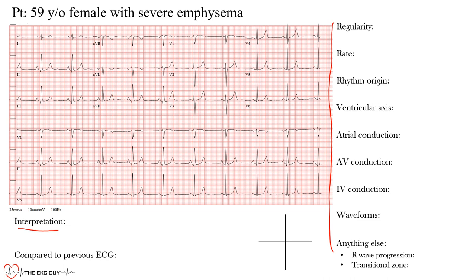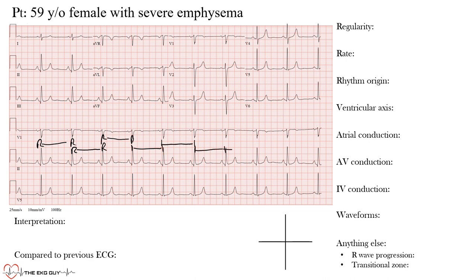When you're ready, start the video and we'll go through this together. So here we have a 59-year-old female with severe emphysema. The first thing we want to do is look at the regularity of the rhythm. From first impression, you probably notice that this is a regular rhythm. When we look at regularity, we can use any interval, but it's always good to be consistent, so we'll use these big R waves — the R-to-R interval.